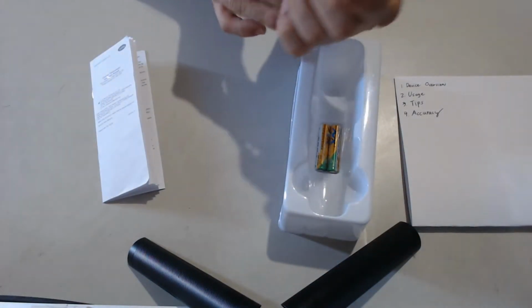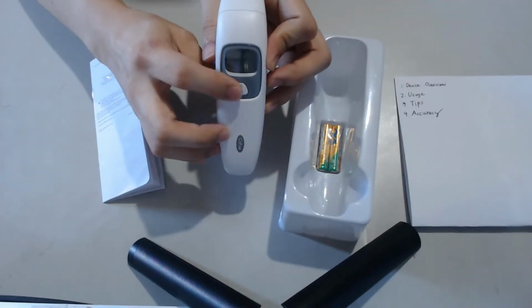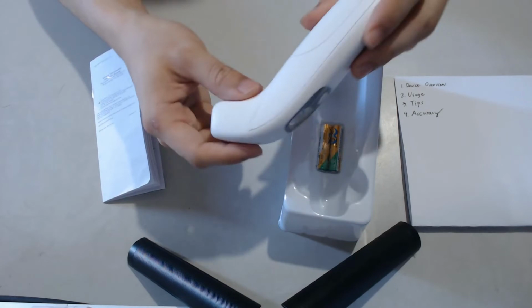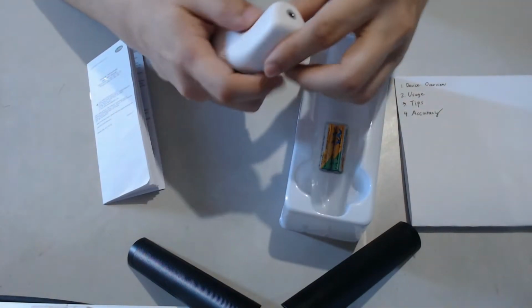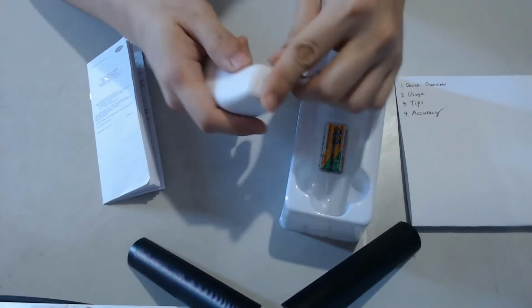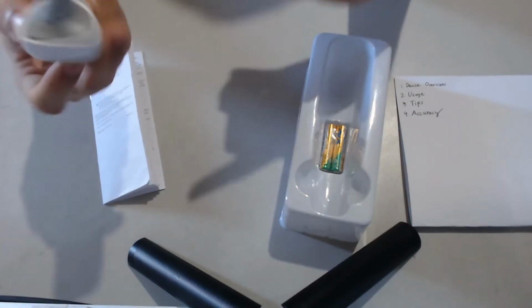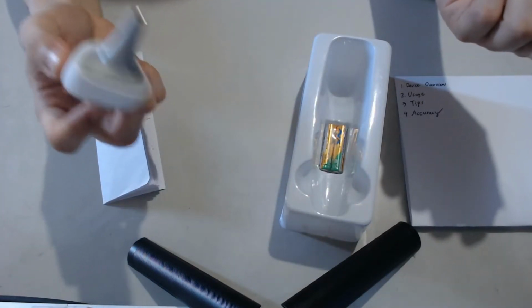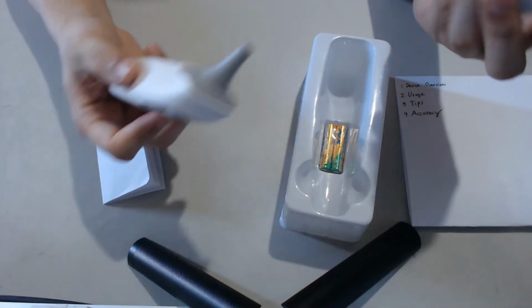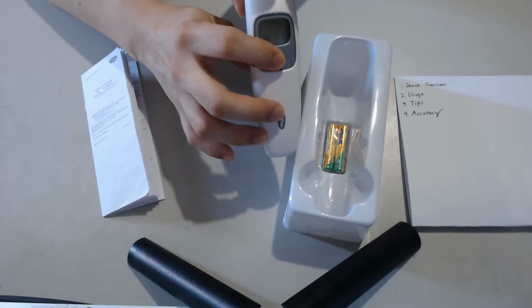The basic usage is easy. It only has one button, and this one is a dual mode. You can use it to measure your forehead and only your forehead, I'll get to that later. Or you can remove this and measure the temperature in your ear. This one is kind of easy to use. Just shove it into your ear canal and press the button and it will beep. It will know that you got the temperature. The temperature is measured. To open it, simply press this button.